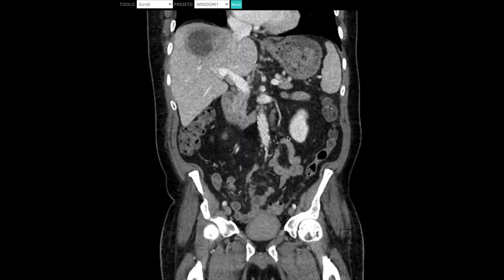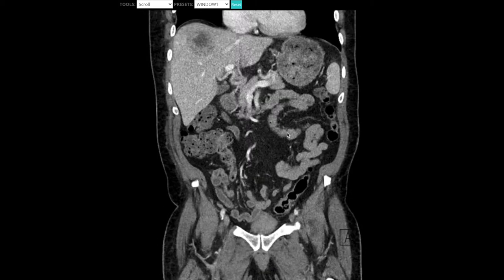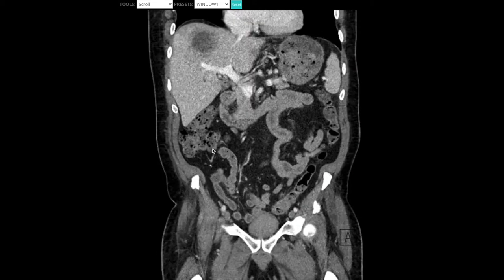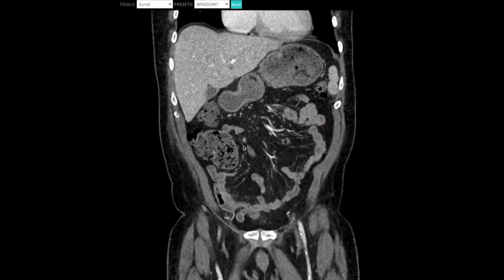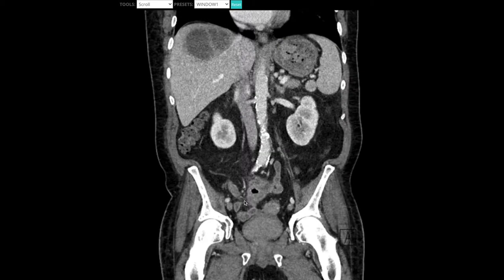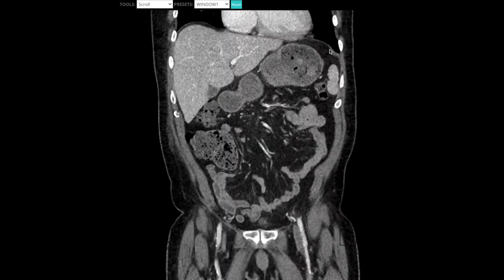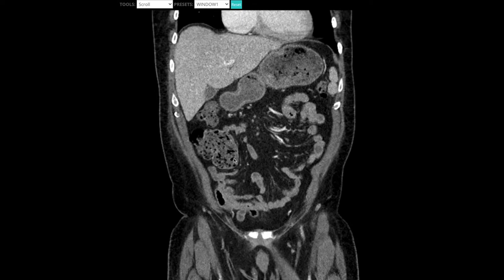The first thing we're going to look at is just how the bowel looks on a coronal view. Clinicians find it much easier to look at this because it's how you're used to seeing KUBs or chest x-rays — it's just a more familiar way of looking at things. In overview: small bowel is going to be in the center, and the colon, aka large bowel, is going to be on the periphery.